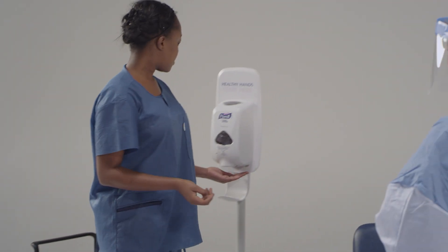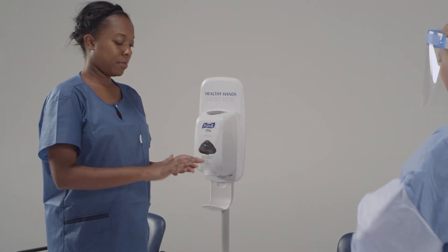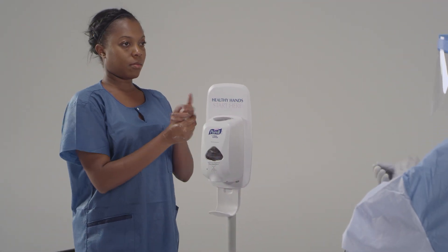Go ahead and perform hand hygiene using alcohol-based hand rub on your bare hands.